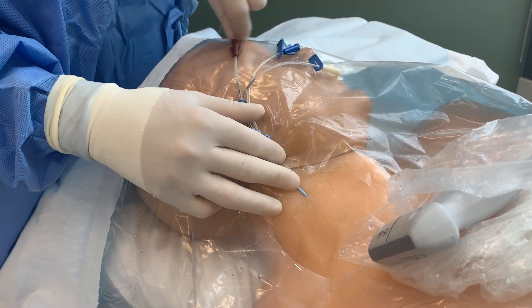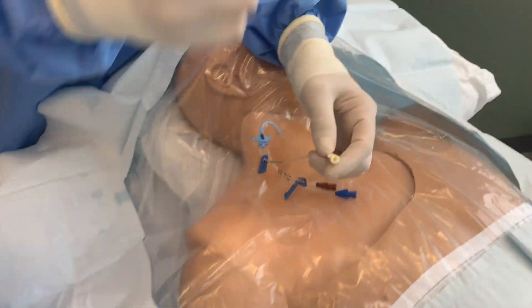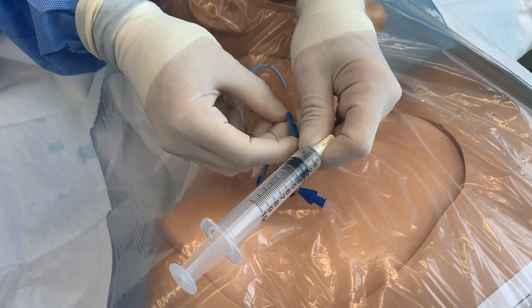While keeping the catheter in place, remove the guide wire through the brown port. Next, with your sterile syringes, aspirate and flush each line. Once completed, cap and clamp each port.